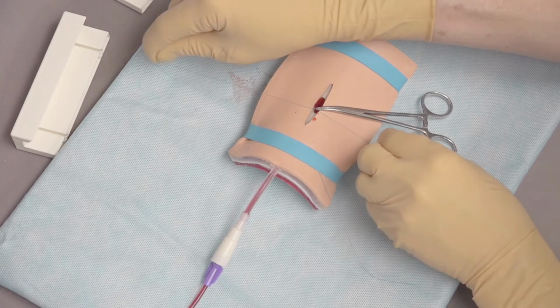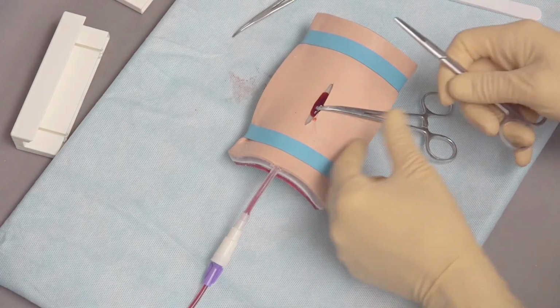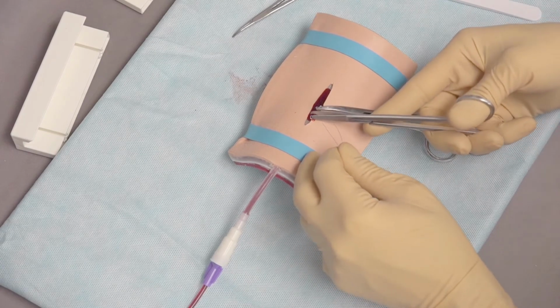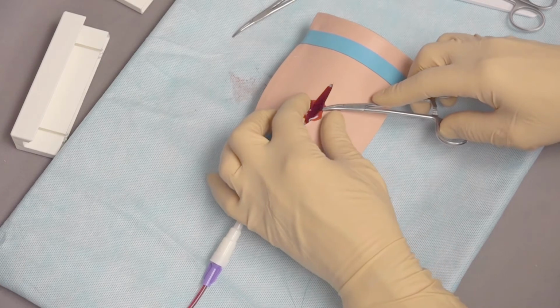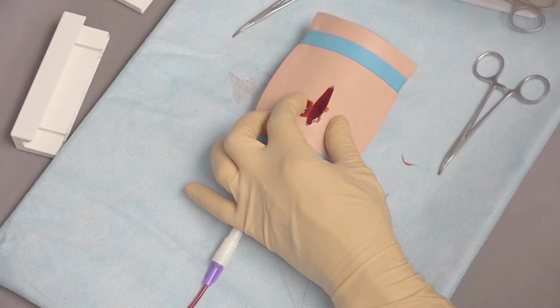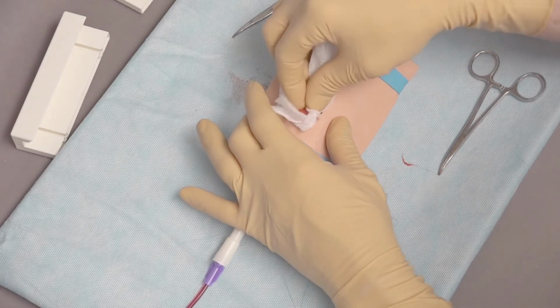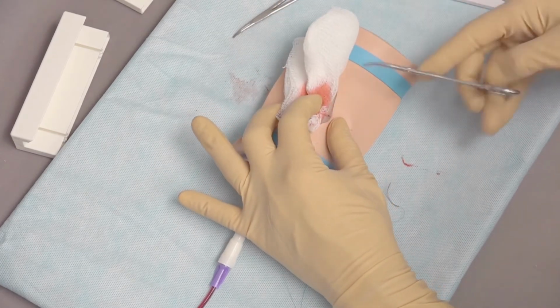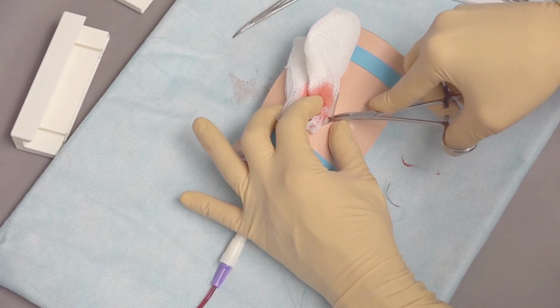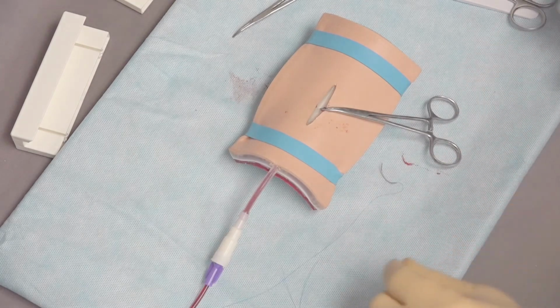This one I'm starting to wonder whether I've got the vessel well or not because I'm getting some hemorrhage. So I have to come back and have another look at that. So we'll come back, put a little tension on here, identify where the vessel is coming, and I think what had happened is that my hemostat came off from the vessel. There, now I've got the vessel.